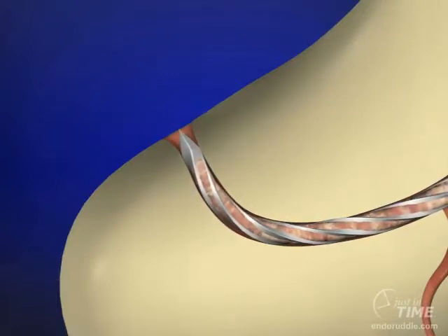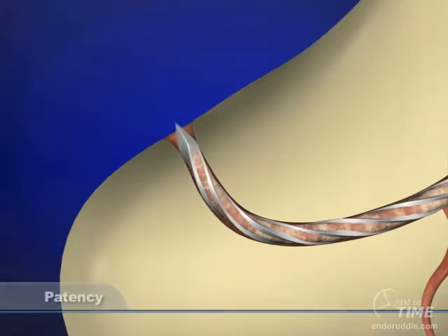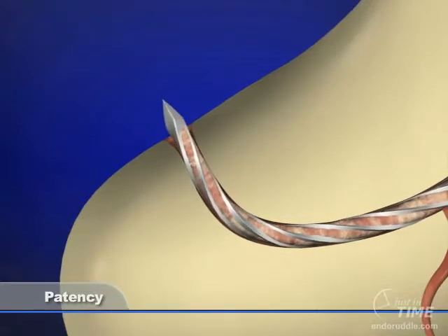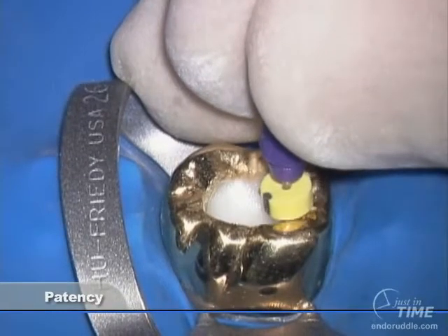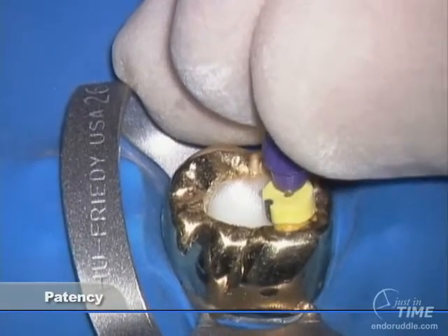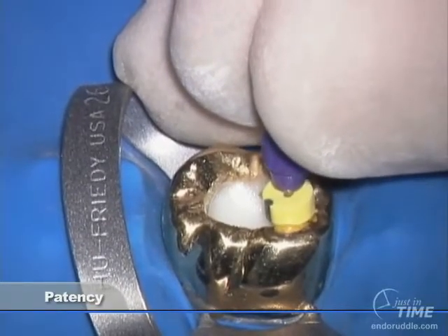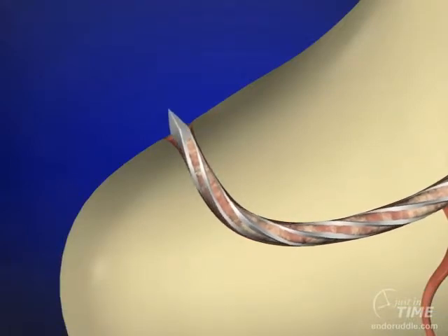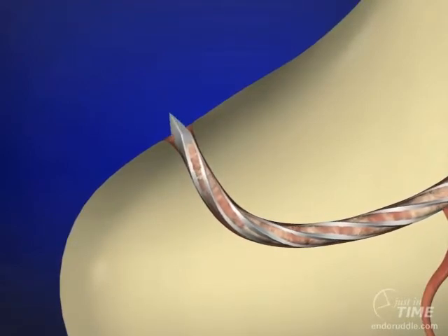The radiographic terminus then would be my working length. It's very important to keep the canals open. This means patency files are repeatedly and deliberately passed through the foramen, as you can see clinically on this first mandibular molar with a full veneer crown. Notice how gentle the instrument is being used, and by using it frequently in this manner, we're transitioning the canal to a slightly larger diameter, smoothing and refining the walls, until at some point we can decide — do we have a smooth, reproducible glide path?